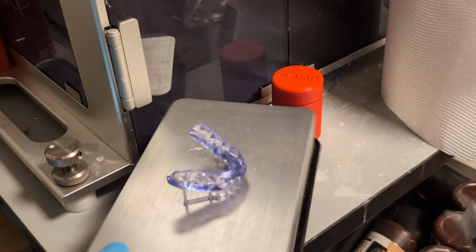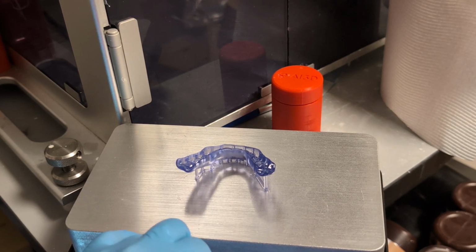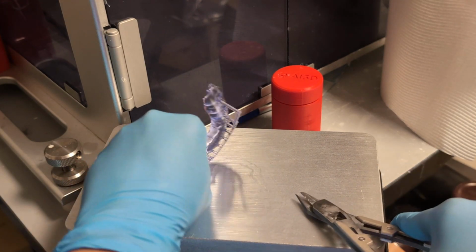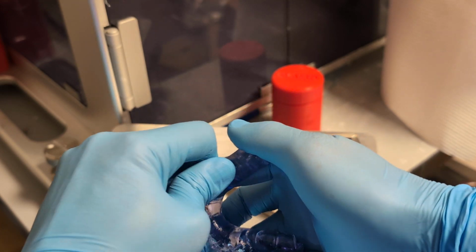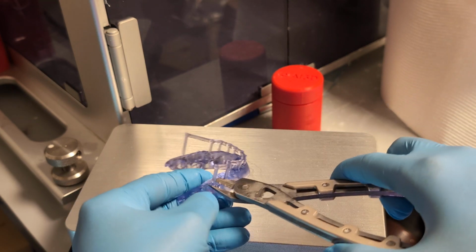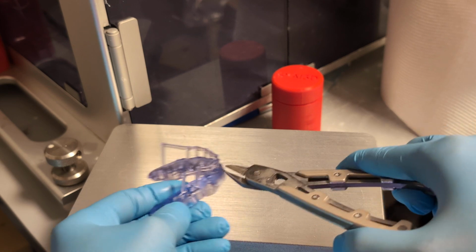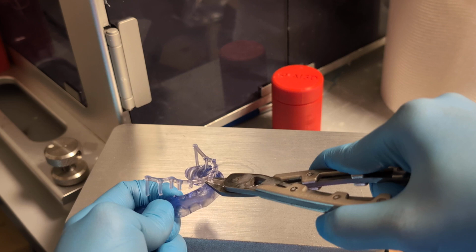So of course, I'm going to do a little bit of gymnastics here, recording behind the phone. Bit of a snip here. Wow, that's super easy to cut off, and really nice. Only a few supports to cut off. With the sprue cutters, we're just going to snip them off like so. Super easy.